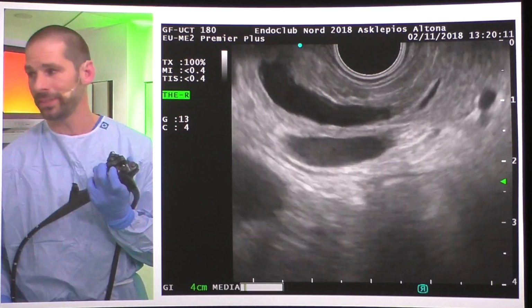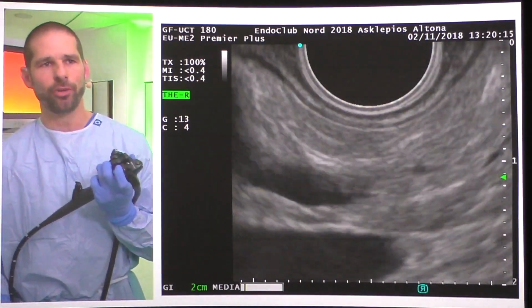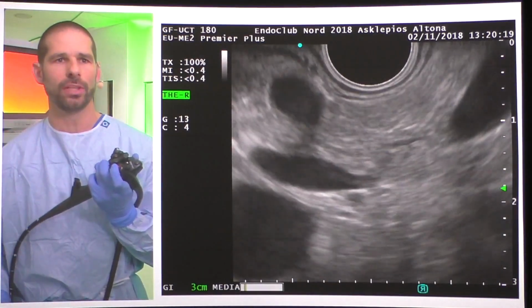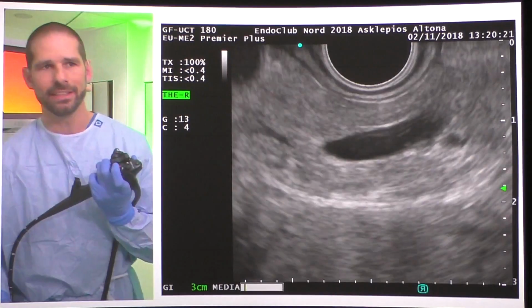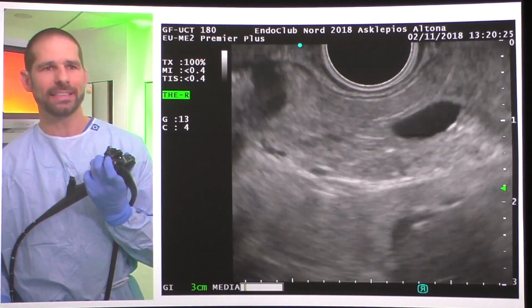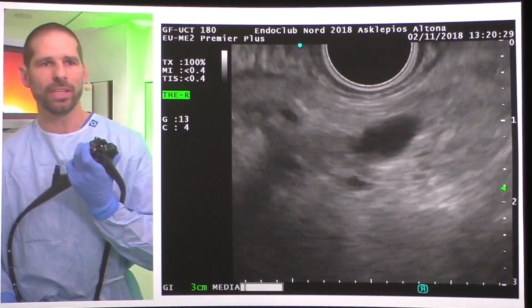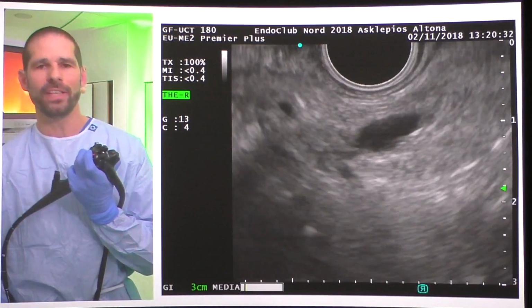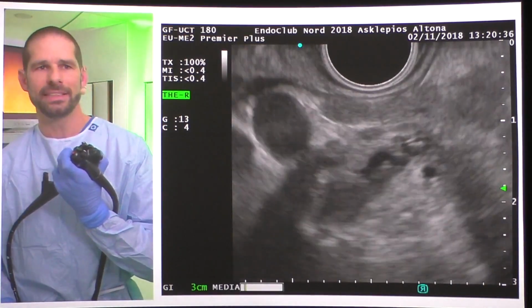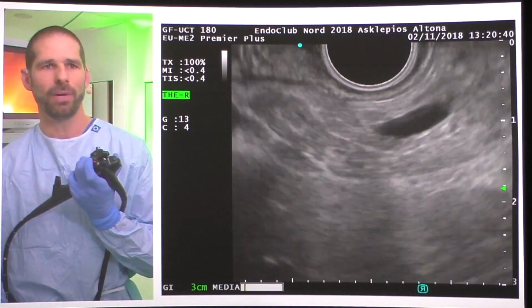You see the parenchyma shows slight atrophy. Now you see it's 5 to 6 millimeters wide. Now you see the splenic artery and vein, and if I turn, you see I move towards the tail. No nodules, no calcification, just the dilated duct with lateral branches. But something is changing here.